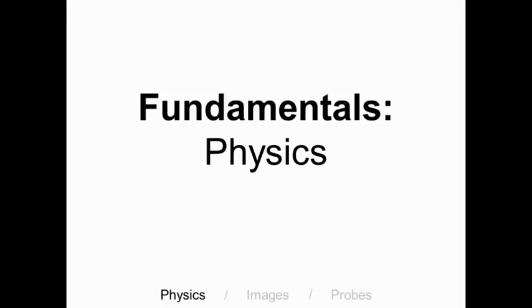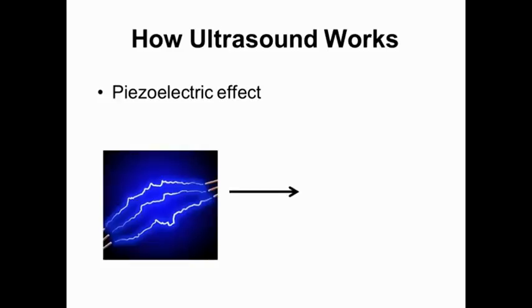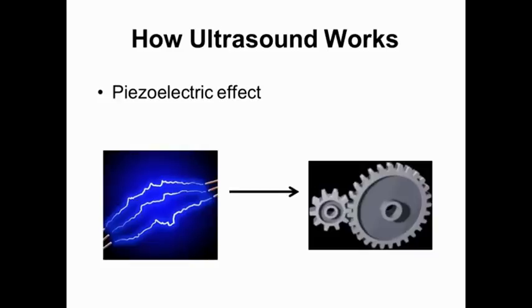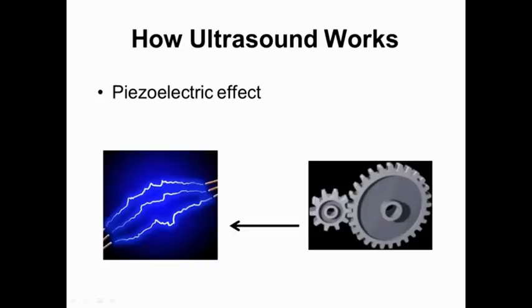Starting with ultrasound physics, we'll focus on two areas, the piezoelectric effect and some basic definitions to help understand how images are created. The foundation of medical ultrasound is the piezoelectric effect, which is a relationship between electric and mechanical forces observed in certain substances, including ultrasound crystals. When electricity is applied to a piezoelectric substance, mechanical change is observed. The reverse is also true. Mechanical distortion of a piezoelectric substance causes electrical charge in that substance. This reversible exchange is how the ultrasound machine interacts with tissue to provide images.